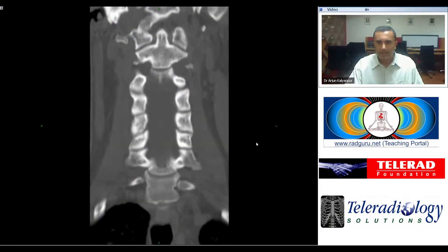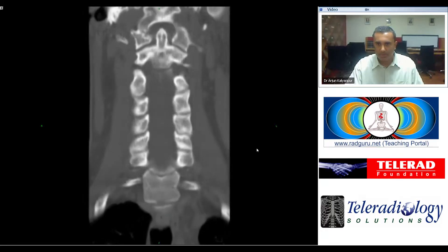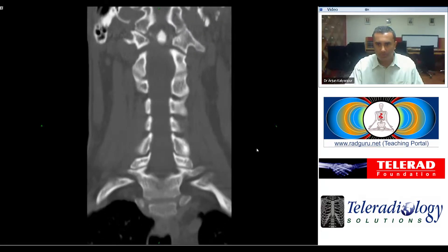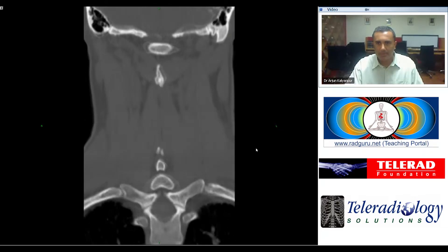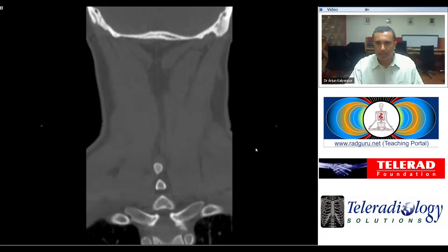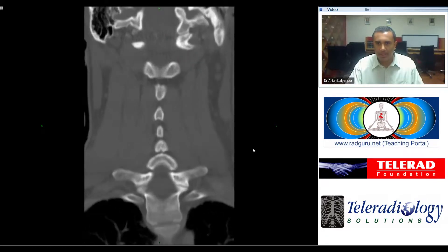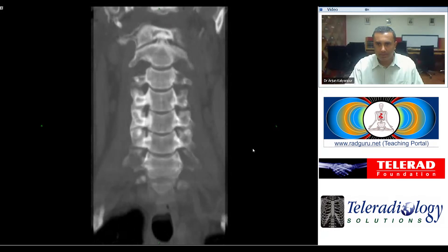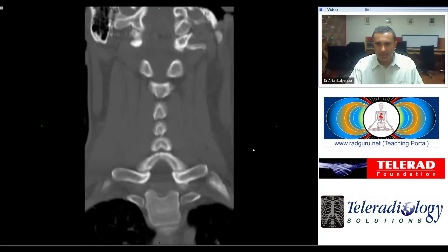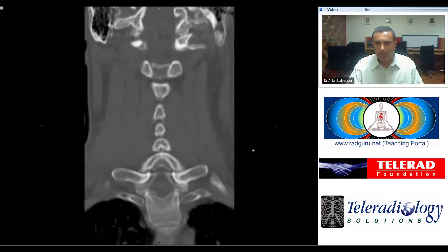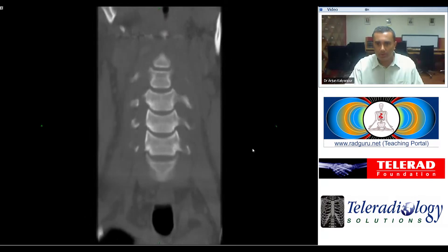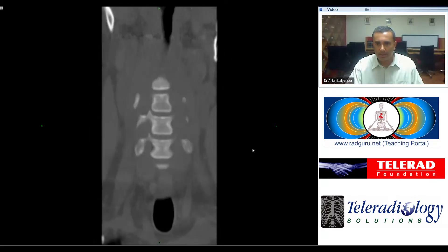This is a CT scan of the cervical spine performed from the emergency room for trauma, which is typically the most common indication for this examination. The purpose of this presentation is to illustrate how important it is to look at all the reformats on cervical spine CT.